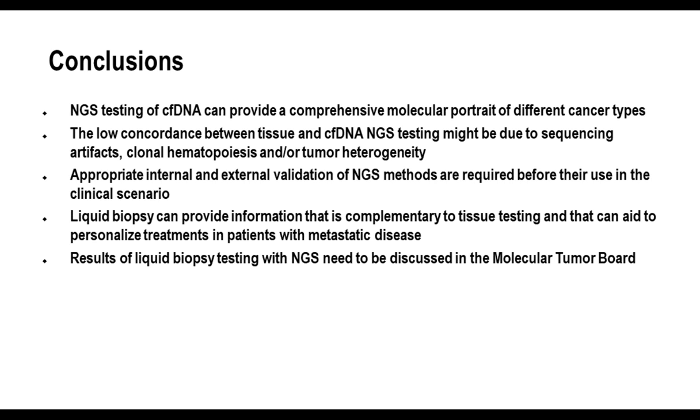However, when we observe the difference between tissue and cell-free DNA testing, often there is a low concordance between these two types of testing, and this low concordance may be due to different factors, either sequencing artifacts or clonal hematopoiesis or tumor heterogeneity. Because of this, it's really important to make an appropriate internal and external validation of NGS methods before you start to use them in your clinical research.